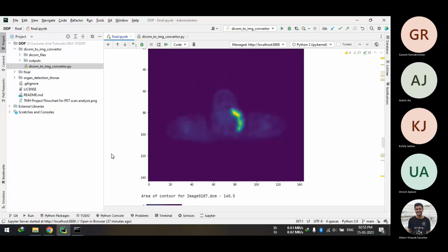So Atharva, you're basically saying, this is in the neck, so you will see 20 images above and 20 images below, to see where the tumor is ending by the PET CT scan signature, and stitch it together. That's what you're saying, right? I don't even have to see 20 above and 20 below. I just have to put a threshold on SUV, and it will give me all the images which have SUV higher than the threshold.